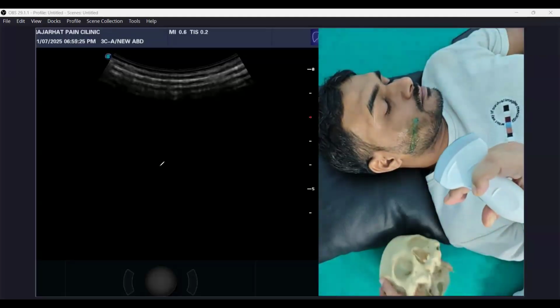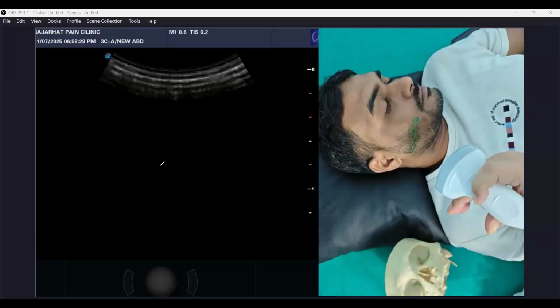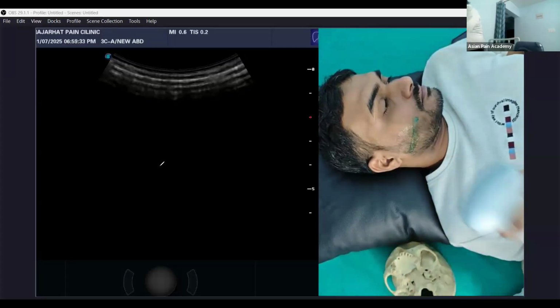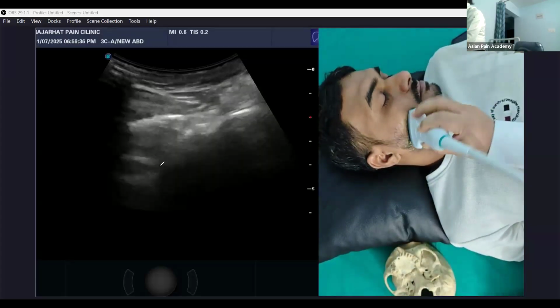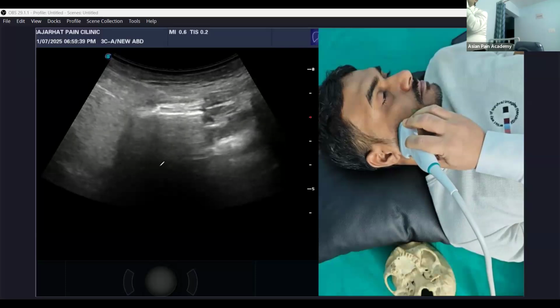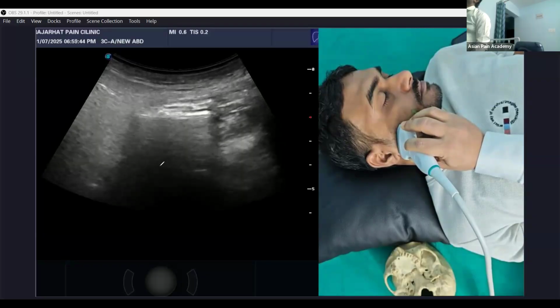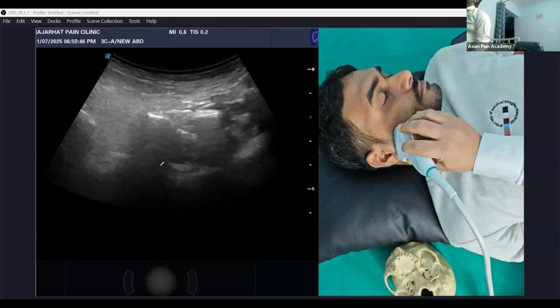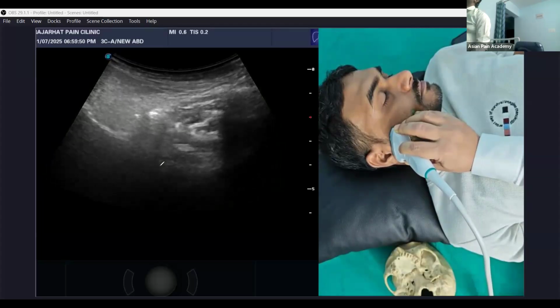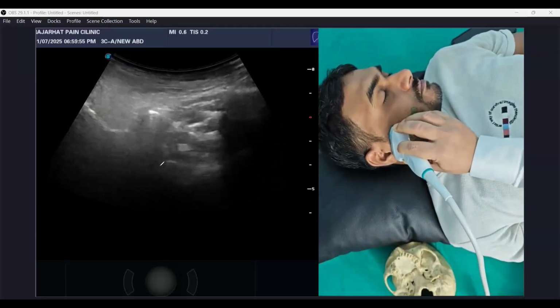We will hit the bundle now, sir, because you are saying adjacent to the plate there are neurovascular bundles. Yes, the neurovascular bundle you will of course hit, but there is no other way. It is very vascular, so there is a chance that you can puncture the vascular structure. This is possible, but we will go with stimulating, isn't it? Yes, sir. As soon as our stimulation becomes positive, we will not go for puncturing. We will be happy with that.